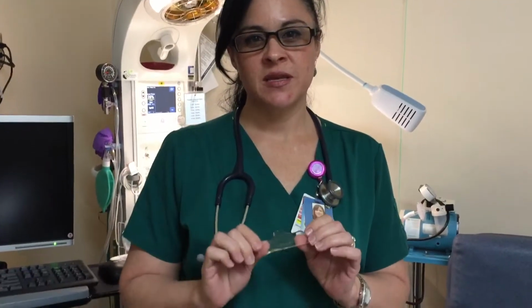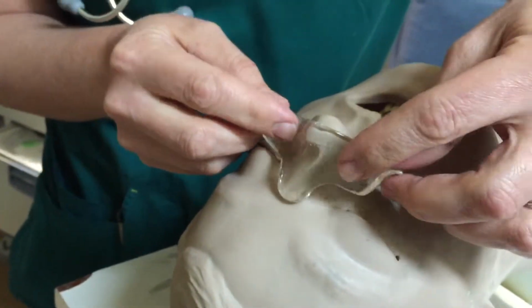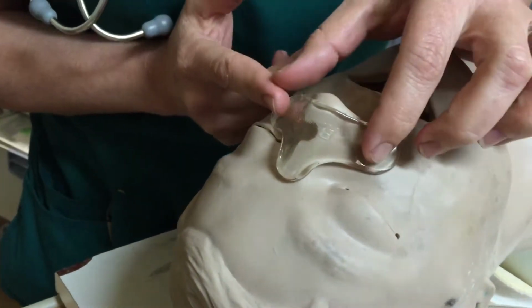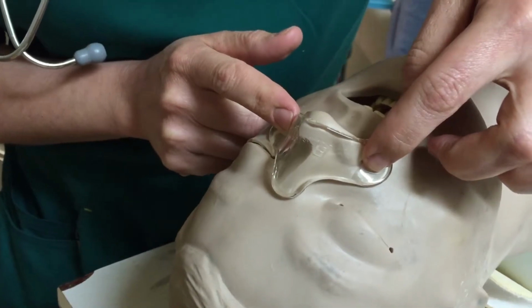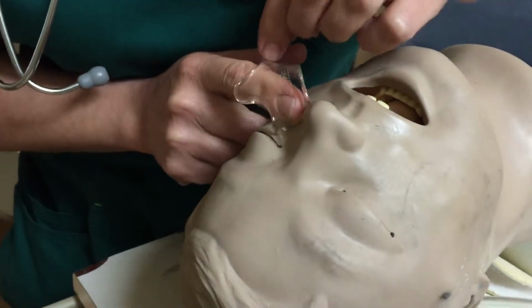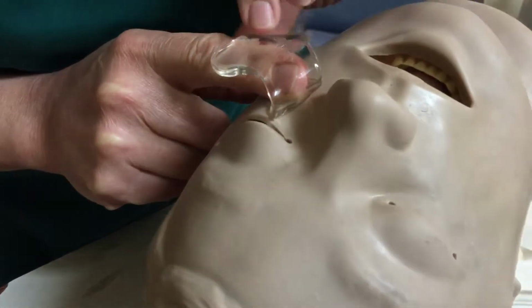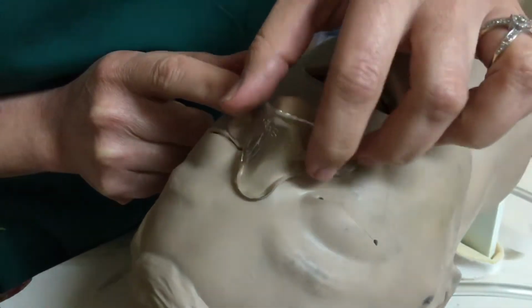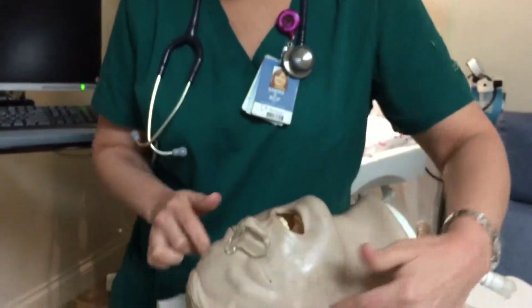Hi, now I'm gonna demonstrate the application of the Gecko. This is a small, so we go to the bridge of the nose with the oval size up, placing it over, and just apply it like this. Every 4 hours when we do a BiPAP check, we're going to be removing it, checking, making sure the skin is blanchable, and reapplying it. At any time that the skin becomes non-blanchable, then that becomes a stage 1 skin ulcer. Then we move to a total face mask to prevent any further damage to the skin.